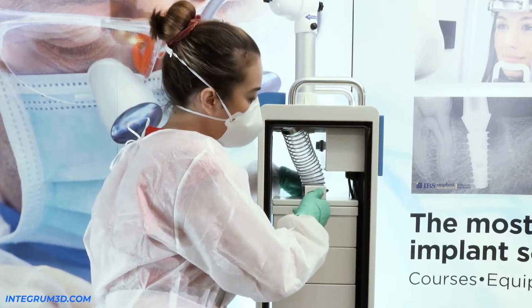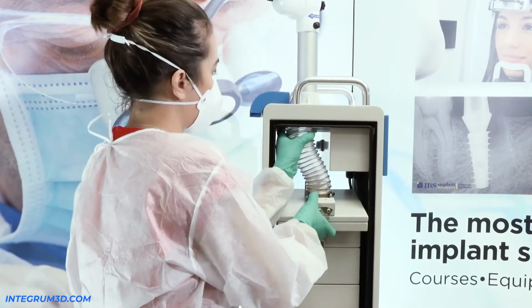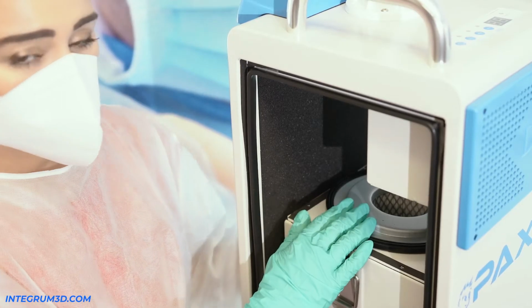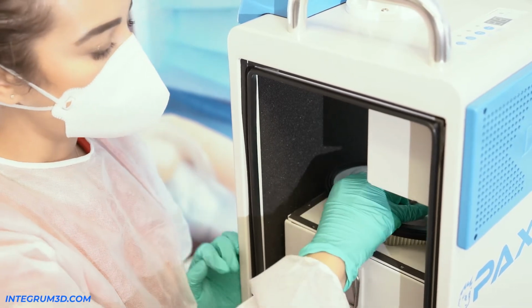Next you're going to get your two handles here. You're going to lift up and bring it out all the way. You're going to put this to the side. In this segment, we're going to go over how to replace the first filter. This is the fine filter.